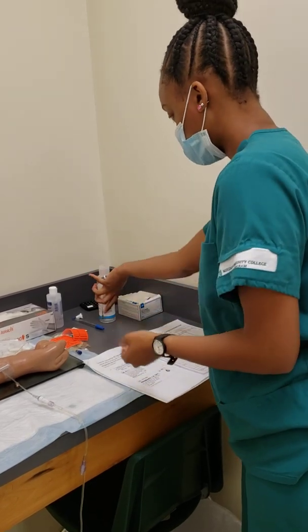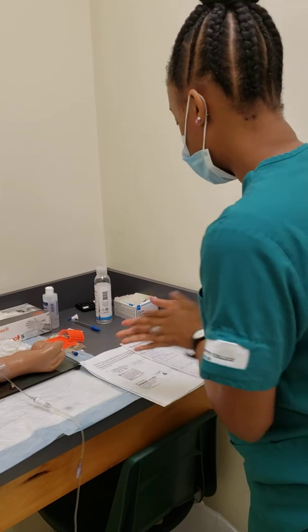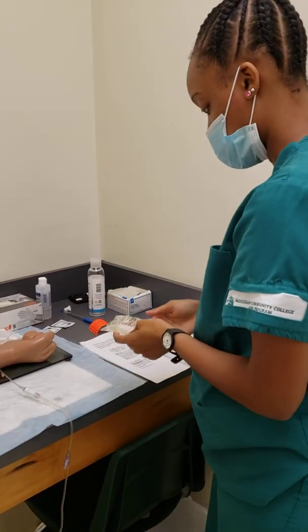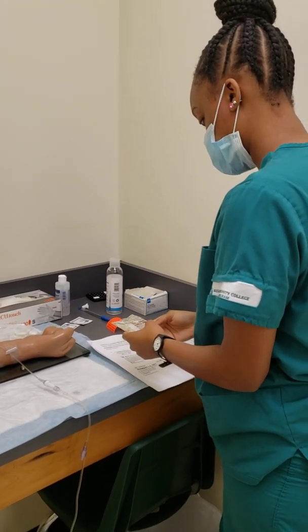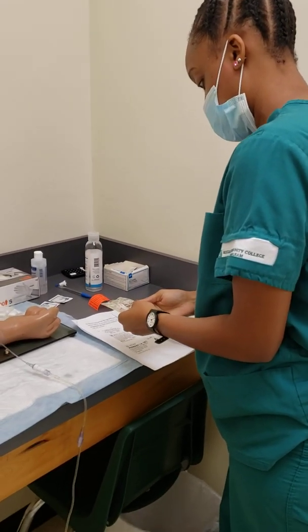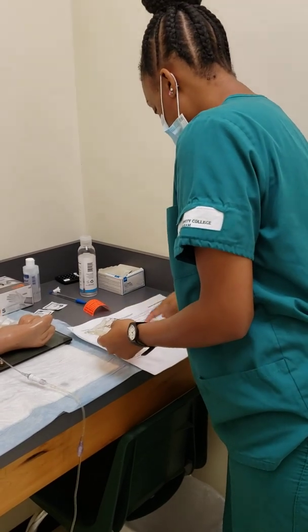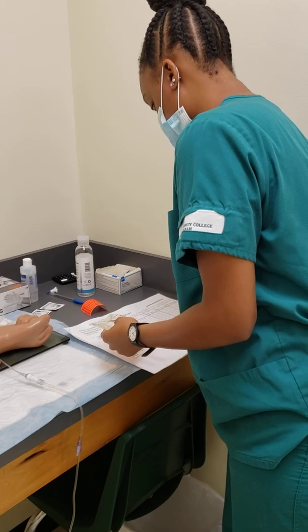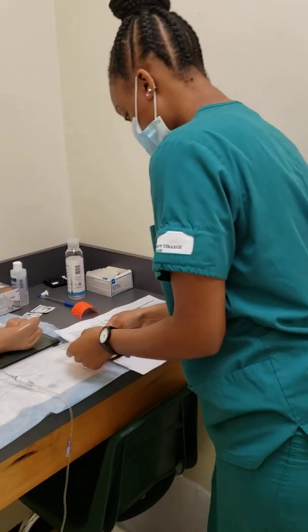medication. Wash my hands. Okay, got my label. I have my gentamicin here. We're going to do my second check. Gentamicin is the right solution, right medication. It doesn't have any sediment or anything floating in the solution. It looks good to me. So we have my patient. Everything matches up. No allergies. Date of birth 4/11/95, and this is going to be given every 8 hours.